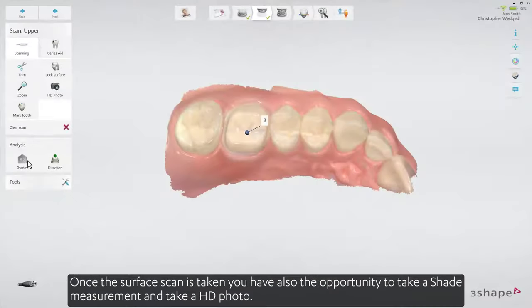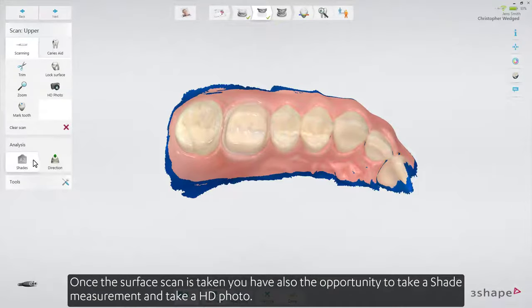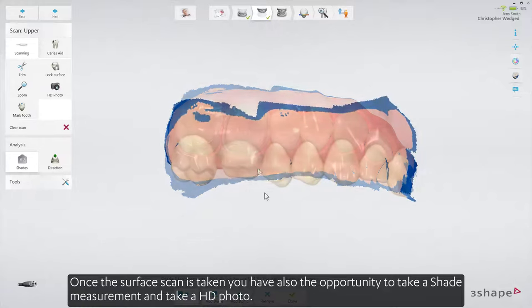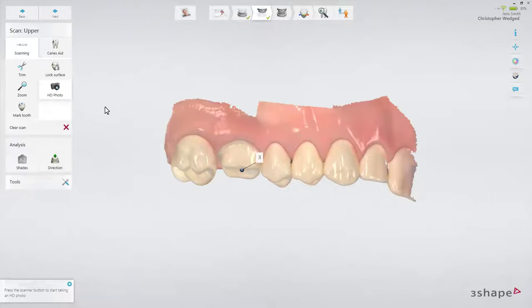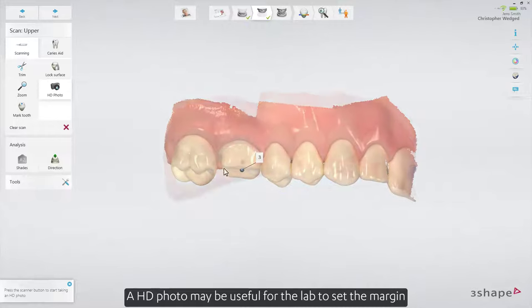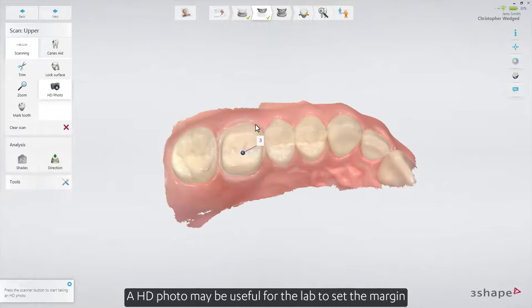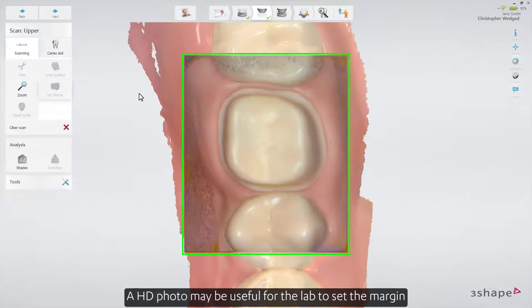Once the surface scan is taken, you also have the opportunity to take a shade measurement and take an HD photo. An HD photo may be useful for the lab to set the margin.